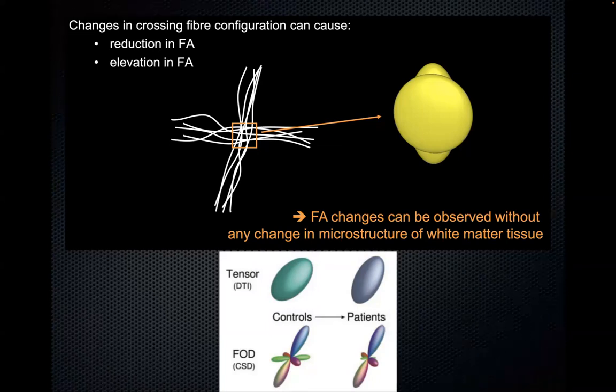Like, what? How do I publish this result? Let's not publish. No, let's go see underneath what's happening. Underneath, what's happening is that the blue and the red peak are the same, but the green peak is changing.